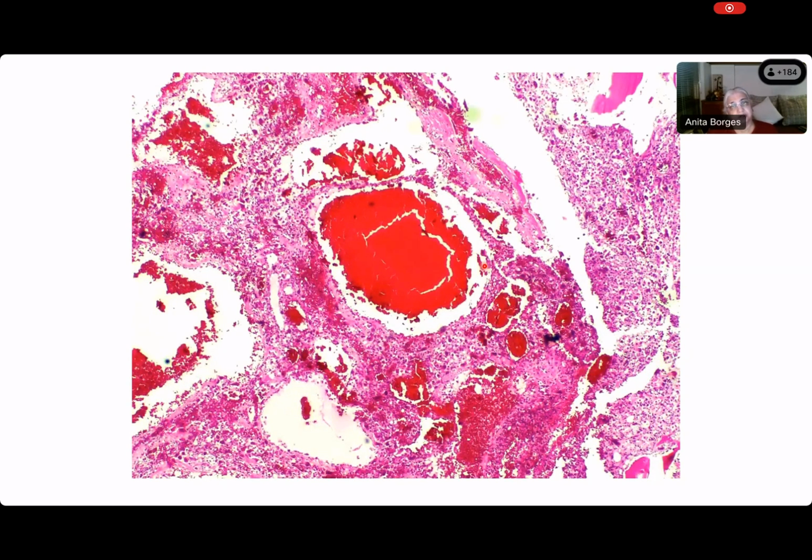Now what do you see here? This large hemorrhagic area surrounded by cells. Large hemorrhagic area. Now, somebody else also said, like Mansi said, I see hemorrhage. So do you think that this is hemorrhage? And if so, who made this hemorrhage? Was it a hemorrhage inside this tumor, or did the surgeon make this hemorrhage? And was this hemorrhage caused by our previous biopsy, or what?